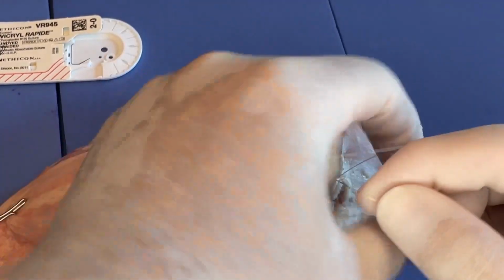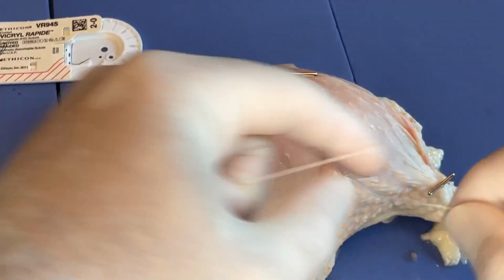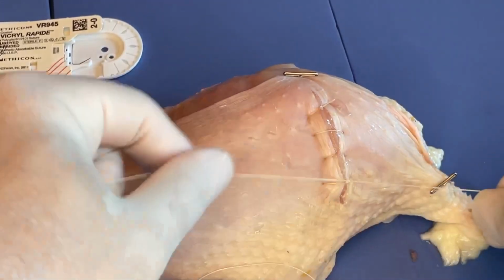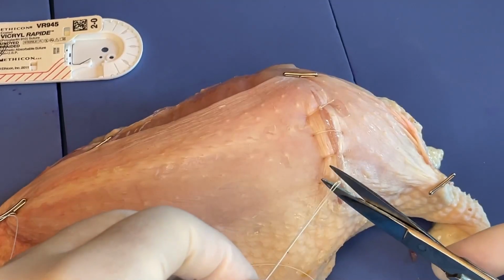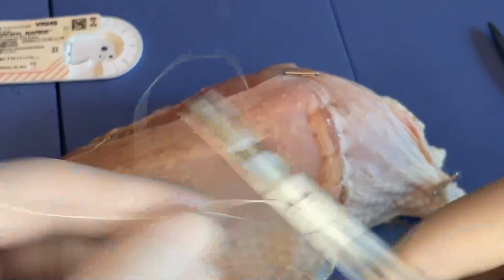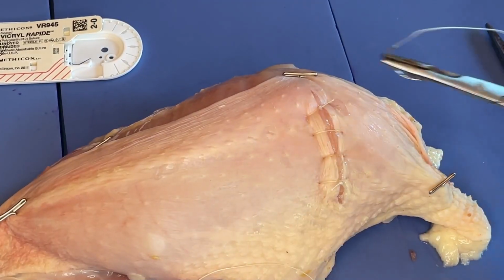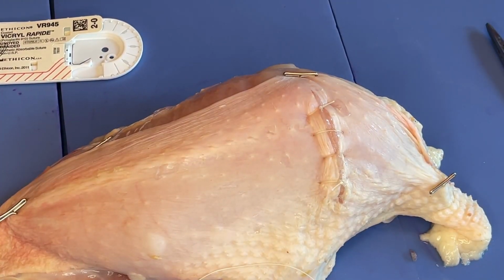It's always a good idea to practice knot tying with a pair of surgical gloves, because that's how you're going to be doing it in the operating room, and so you want to get that feel for handling instruments, handling suture, tying suture with surgical gloves on. So there you go. Simple interrupted with exposed knot and buried knot.